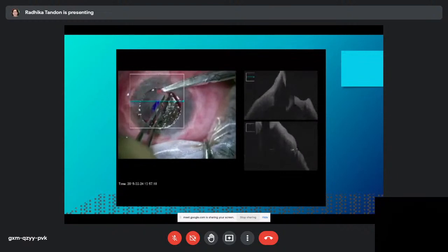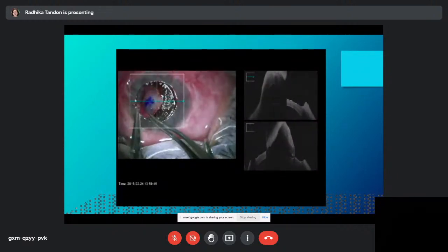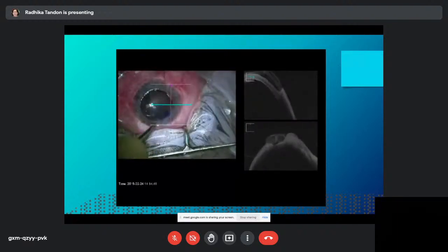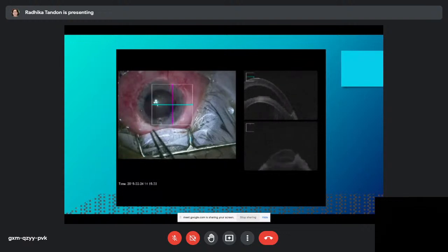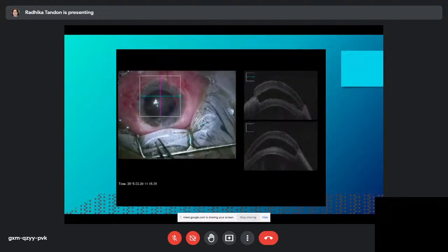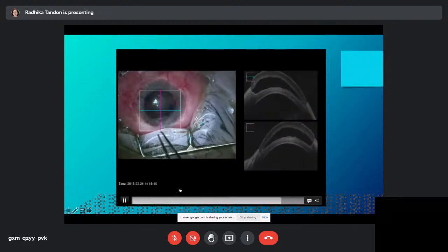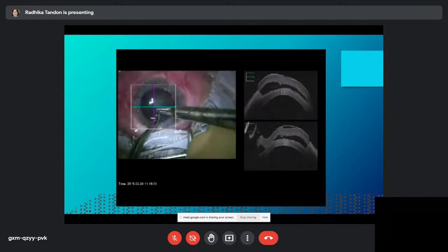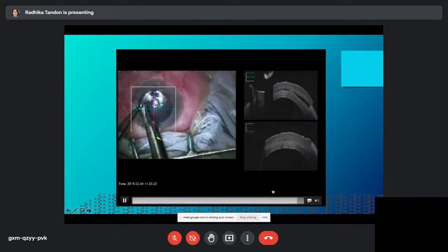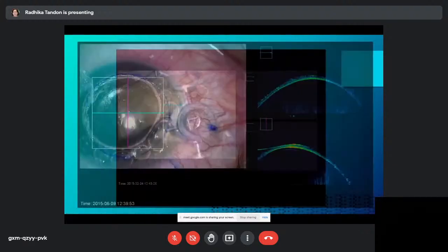It is calculated. Basically, one quarter turn cuts at about 62 microns, and you decide initially how much depth you want, and you go accordingly. The benefit of the vacuum trephine is that it gives you this graded depth, and it also secures the host so that you can very comfortably center it appropriately, and it is a more controlled method rather than using the traditional manual trephines.